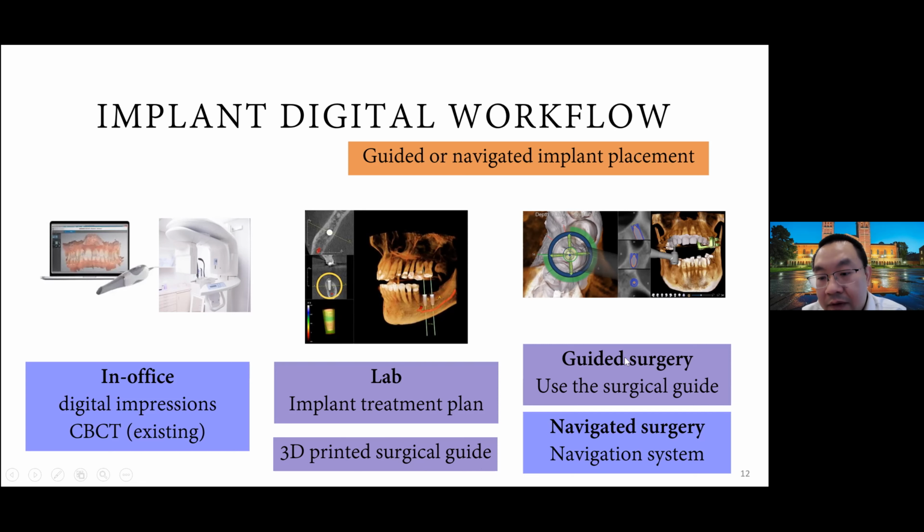And the new thing is called navigated surgery, which is different from guided surgery. Guided surgery is when you as a surgeon are guided by the surgical guide, right? A navigated system is almost like a robotic surgery where you have additional controls on your handpiece. So the computer tells you exactly whether or not you're deviating from the surgical plan, right? And it will tell you that you will encounter a lot more resistance if you're deviating from the original insertion path. So when you're drilling along the way, it's going to show you a lot more information, all right?